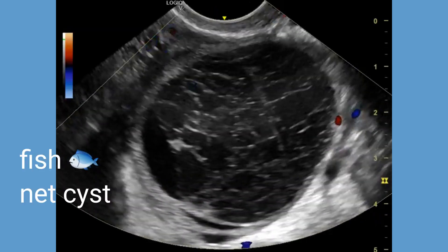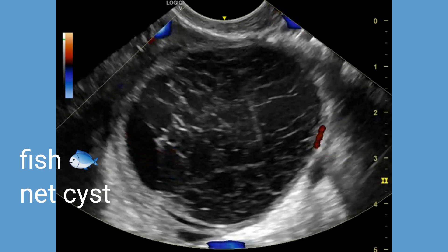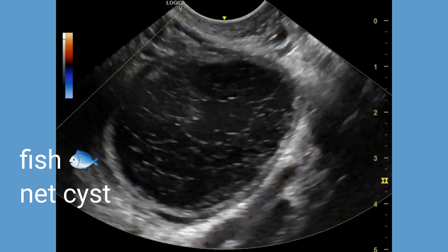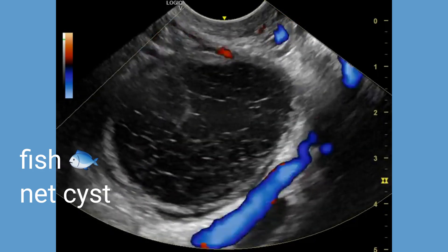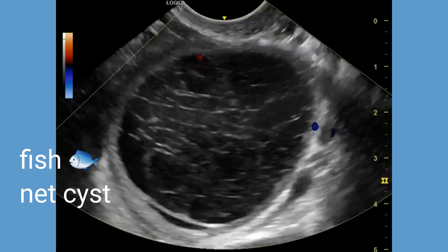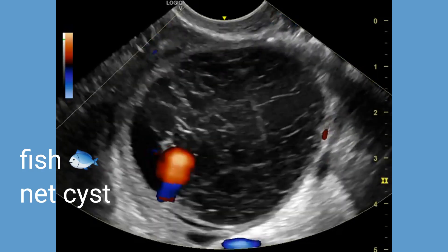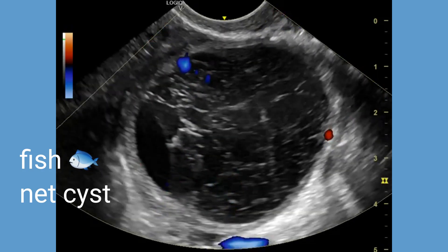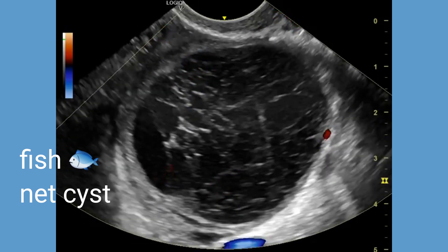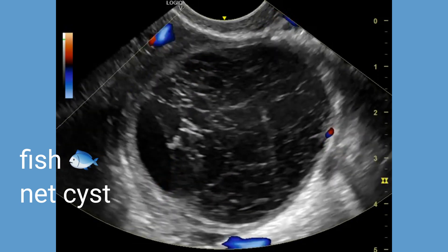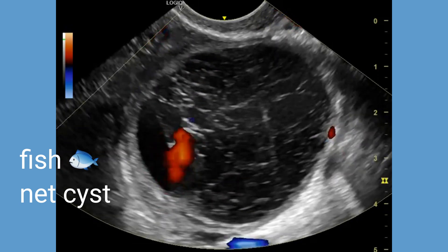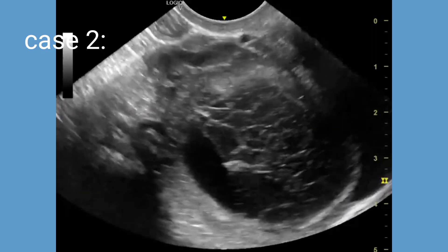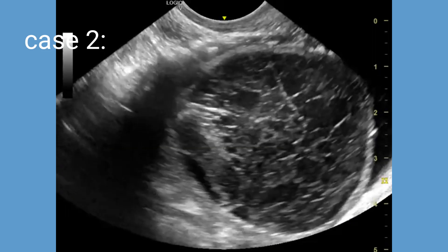These septations may have a criss-cross or irregular pattern resembling the appearance of a fishnet or lace. The fishnet appearance can be seen in certain hemorrhagic cysts and can help differentiate them from other types of ovarian masses. It is one of the features that radiologists use when studying hemorrhagic ovarian cysts.